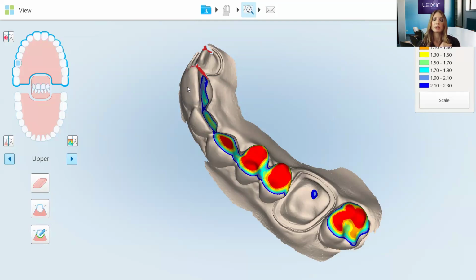The only time I really use the selection tool is if I'm having stitching issues and I need to erase a certain area because it didn't stitch right. Typically I use the eraser tool more because I can be more definitive. The broom sometimes sweeps too much away, so I like to use the eraser tool a little bit better.